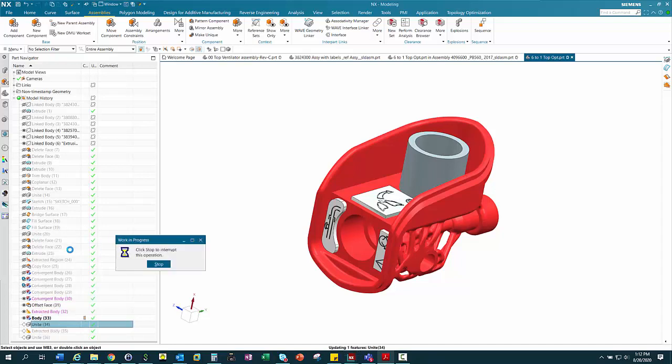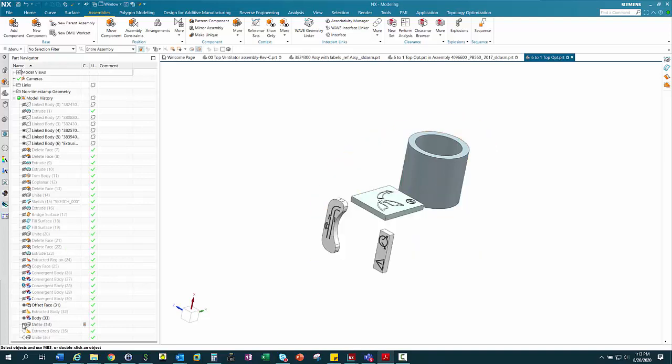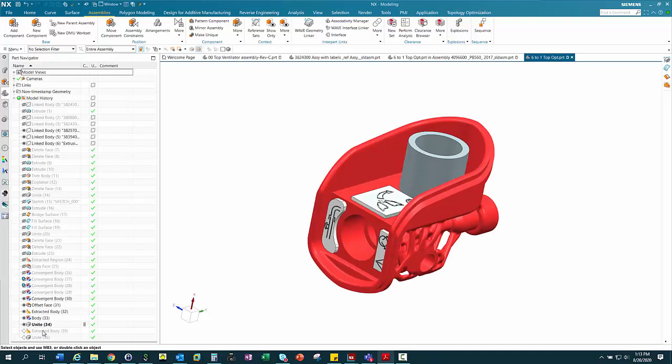So basically we could do what we've been doing for generations in CAD with traditional modeling, and take faceted data, whether it's made with topology optimization or a scanner, and we can merge these worlds together, and we could come up with different design scenarios that work together.